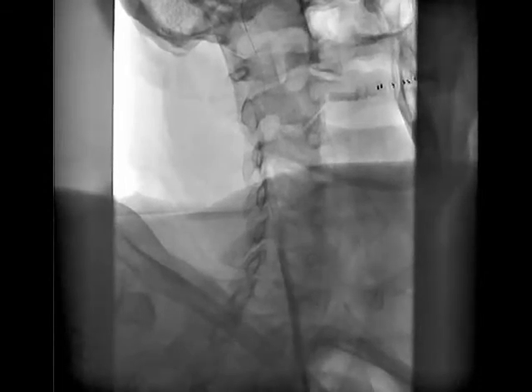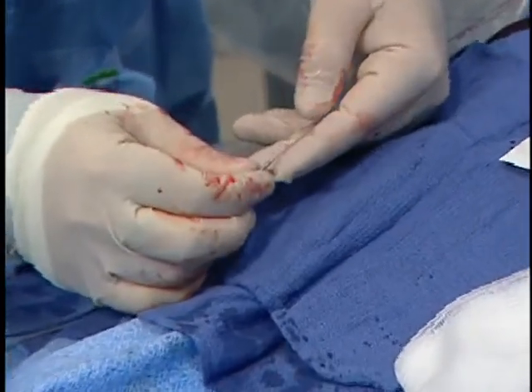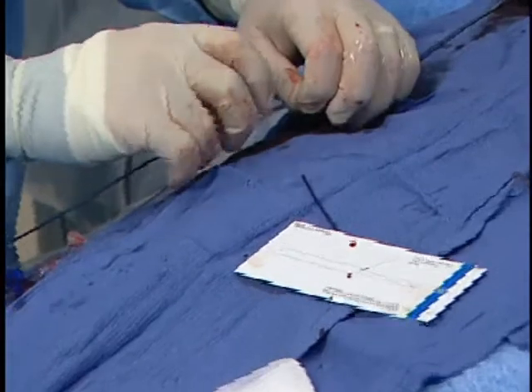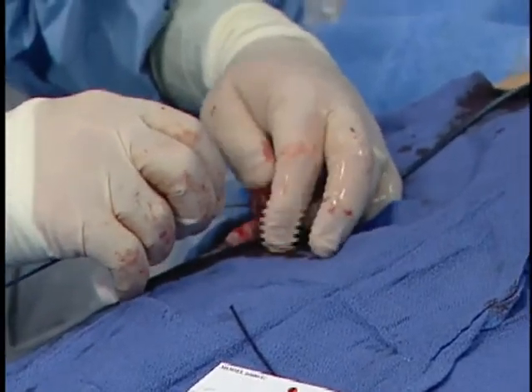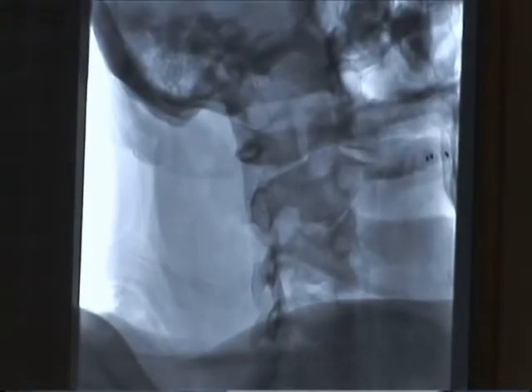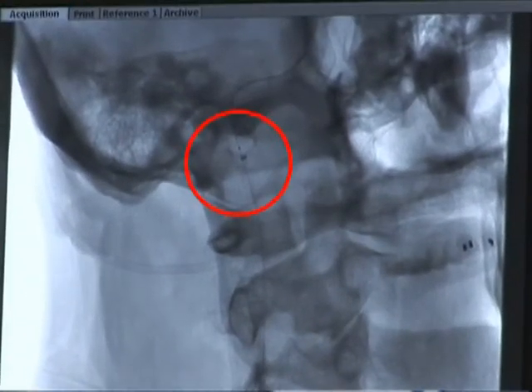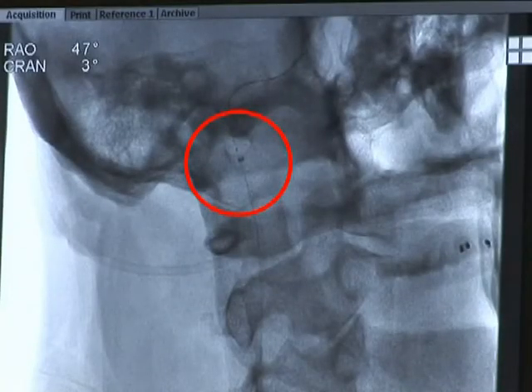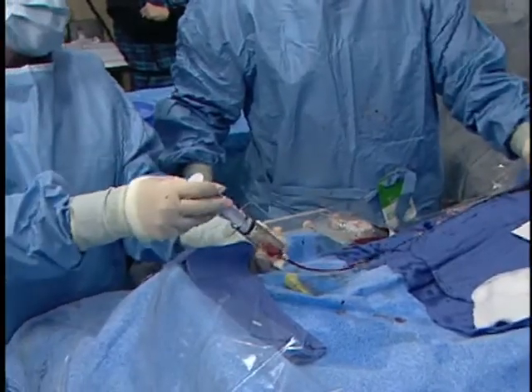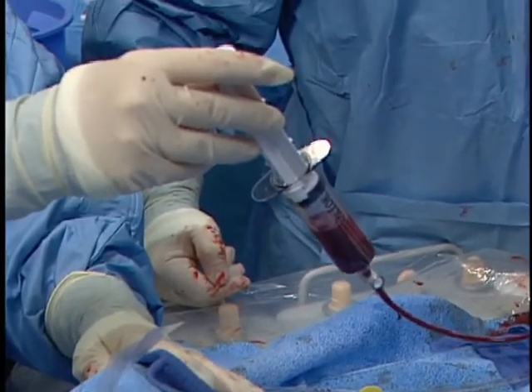We're going to go ahead and retrieve our filter. This is a monorail sleeve — we essentially have the aspiration catheter loaded on the wire. What we're going to do is bring this right up underneath the filter. There's a slight curve on this catheter that allows some directional support to get through more tortuous arteries. The aspiration catheter comes through the stent with no problems. That distal marker right there is the distal end of the filter — we're going to park that right there. We're going to make one aspiration of about 20 cc's to clear any debris in the column between the filter and the stent.